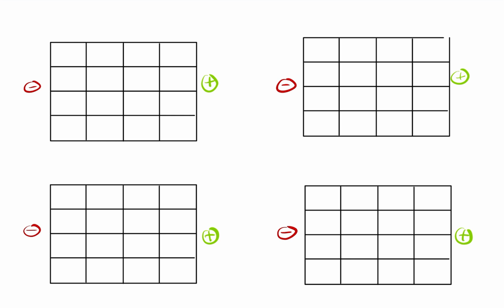We can measure what's inside, but it would be a more invasive method, because you would actually have to put the electrode inside of the cell, and it's not as easy as measuring the potential outside. So that's why we've got these electrodes here, and we are measuring outside of the cells. Just note that with ECG we always measure outside of the cell.